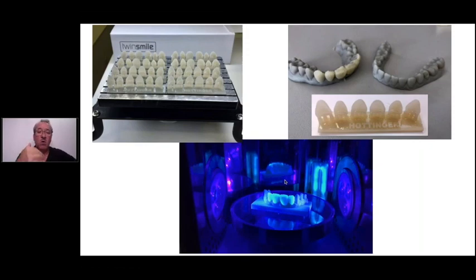We are at the moment in the stage where we are developing soft tissue for models where you want to have pink tissue on it. So when you do your implant designs, you have red tissue and the color of the model. You can remove it, tissue soft. So that's very easy. It's working very good.